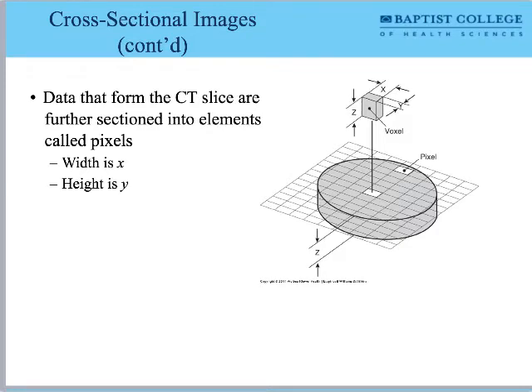So, critical thought. If I've got a little patient laying on this exam table, their head is that way. They're supine on this table. What would the top of the y-axis represent on the patient's body? Would it be anterior, posterior? It would be anterior. Good. And as I move down the y-axis, I'd be moving more posteriorly on the patient.